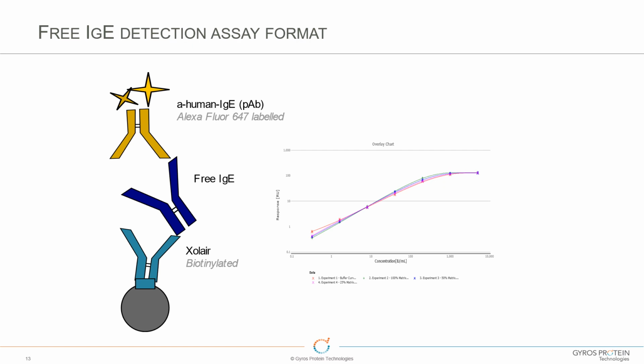What we wanted to avoid was any difference in affinity of the assay reagents to the actual complex. So by using the drug, we at least know that the drug has the same affinity as the drug in solution. Right, and so just like we saw in the previous example, where a difference of affinity could have shifted the results one way or the other, made it very difficult to understand what the real drug target interaction was like in the samples. Yeah, we felt that it would give a more accurate determination of the free by doing that. But what we did is we set up the standard curves in different percentages of matrix.